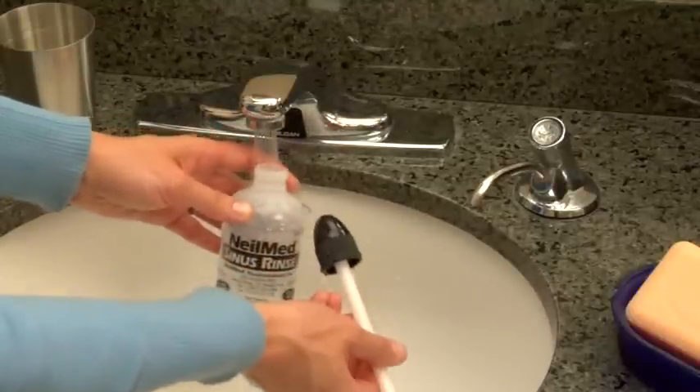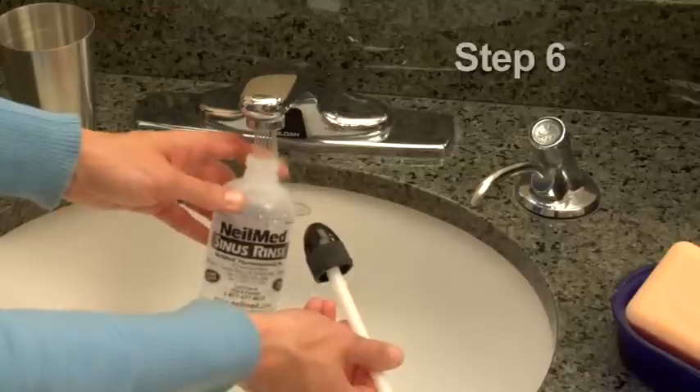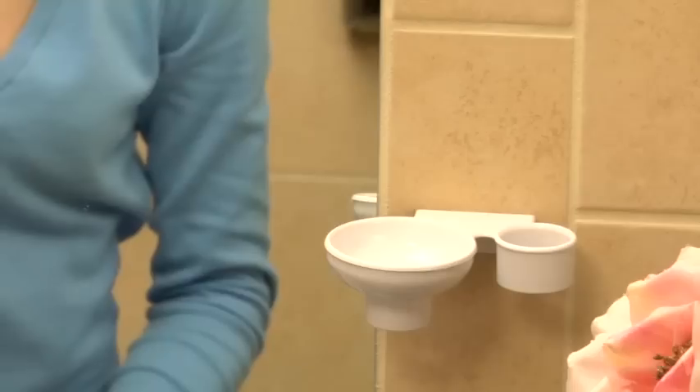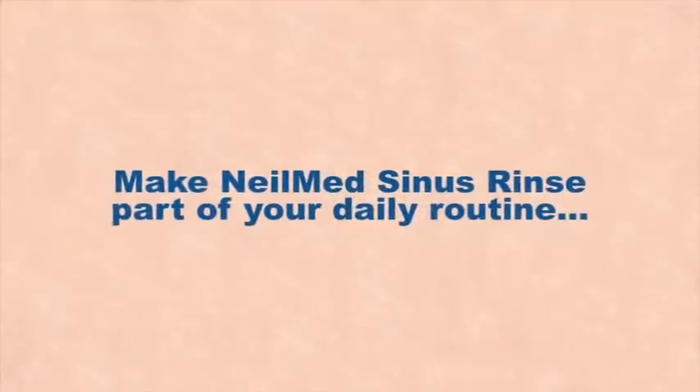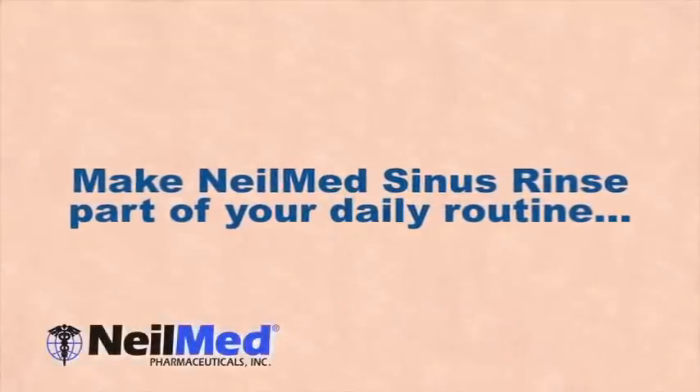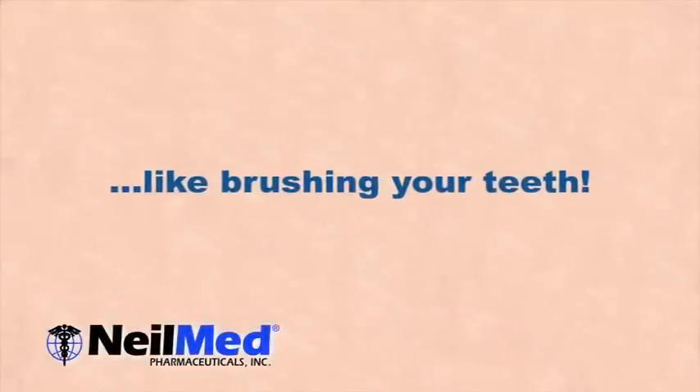Remember, there are no preservatives in the solution. Air dry the Sinus Rinse bottle and cap on a clean paper towel or the NeilMed Nasadoc, which is also used for storage. Make a fresh solution each time you rinse. It's best to rinse once or twice a day, or as directed by your physician.